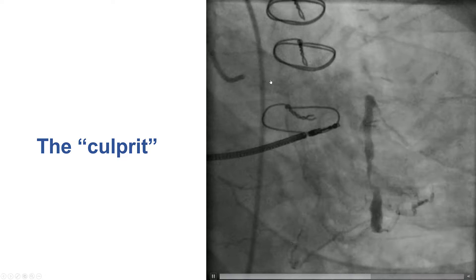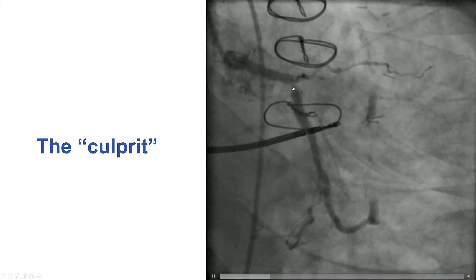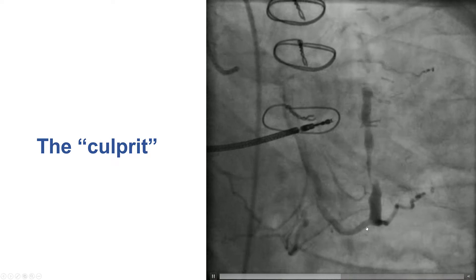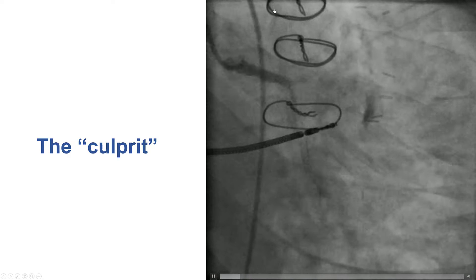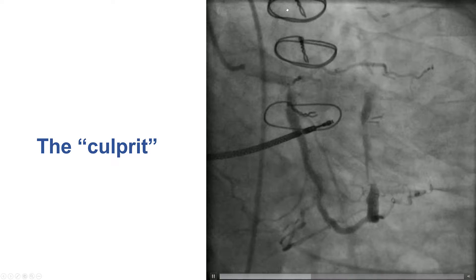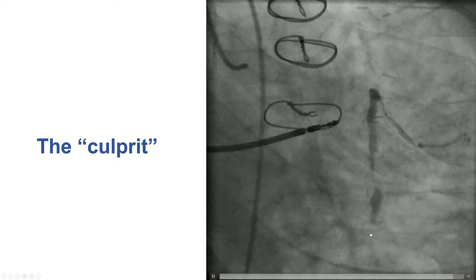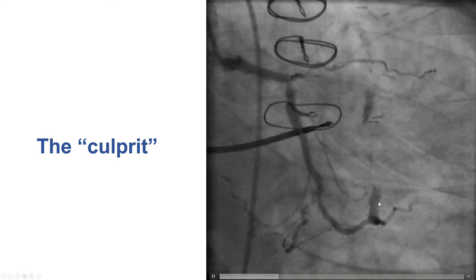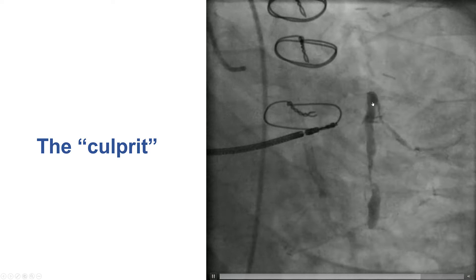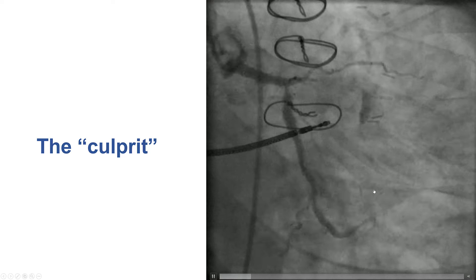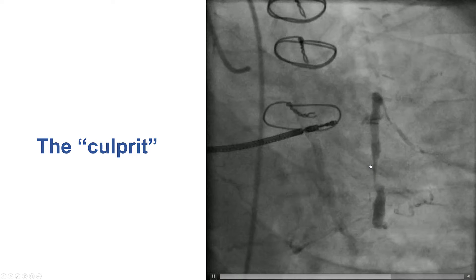Diagnostic angiography demonstrated an occluded LAD. There was an ostial lesion in the circumflex and filling of the 2nd obtuse marginal branch. The sequential SVG to OM1 and OM2 was occluded proximally, but the segment between OM1 and OM2 was patent, and the 1st obtuse marginal was filling retrograde via this SVG segment. This had a severe 90% lesion that was the culprit for the patient's presentation.